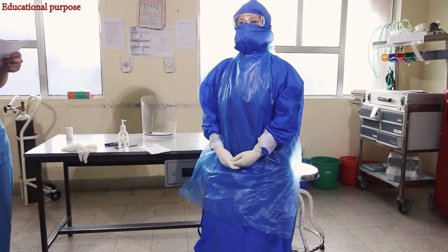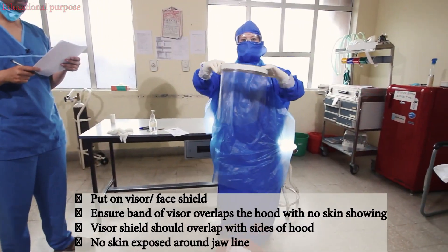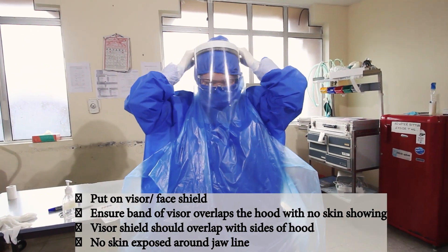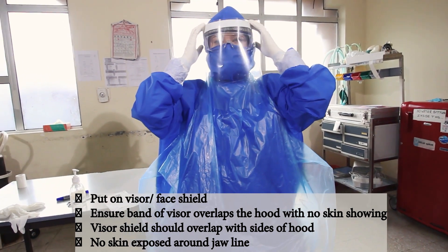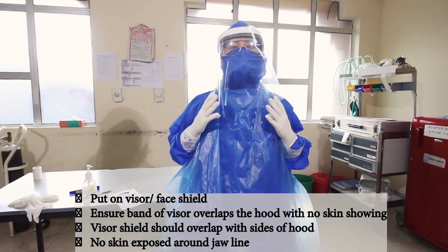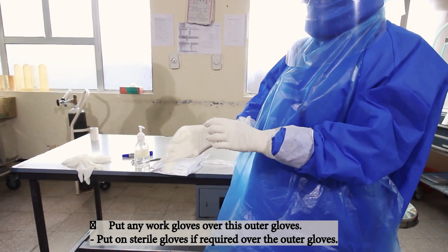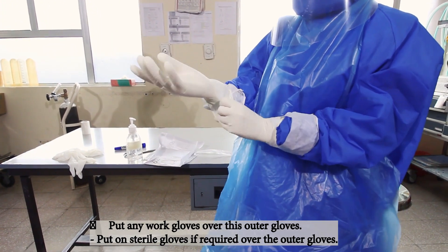Now we'll put on the visor or the face shield. Ensure that no skin is showing and that it is around the jawline and to the sides of the hood. Now put on any working gloves or sterile gloves as required for the procedure.